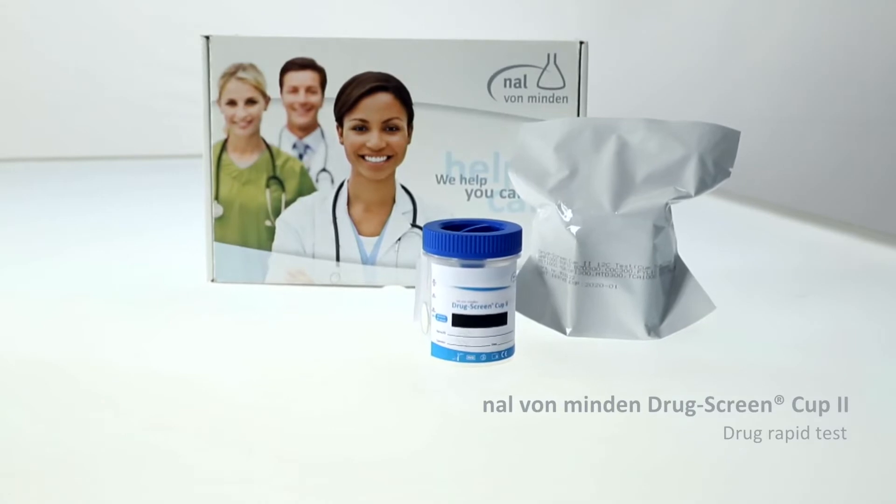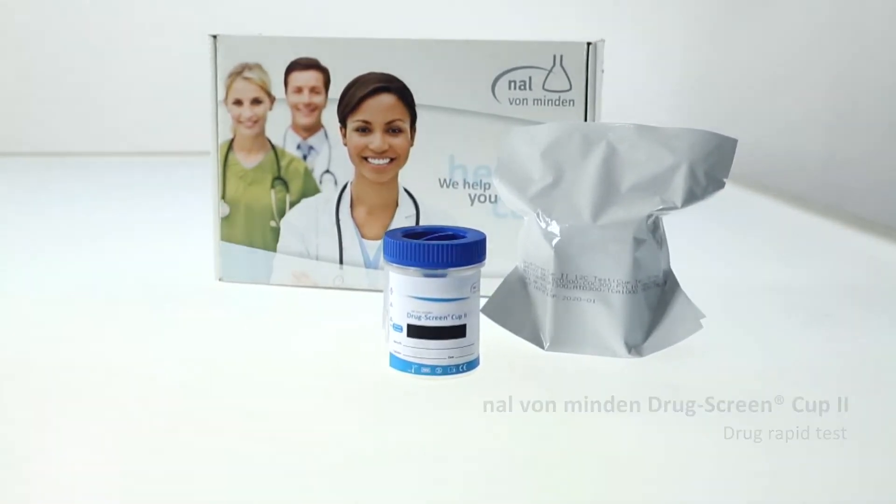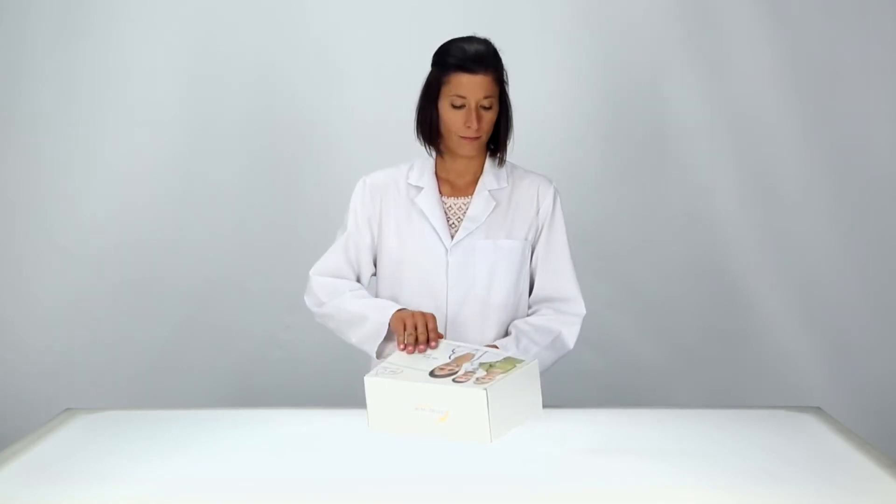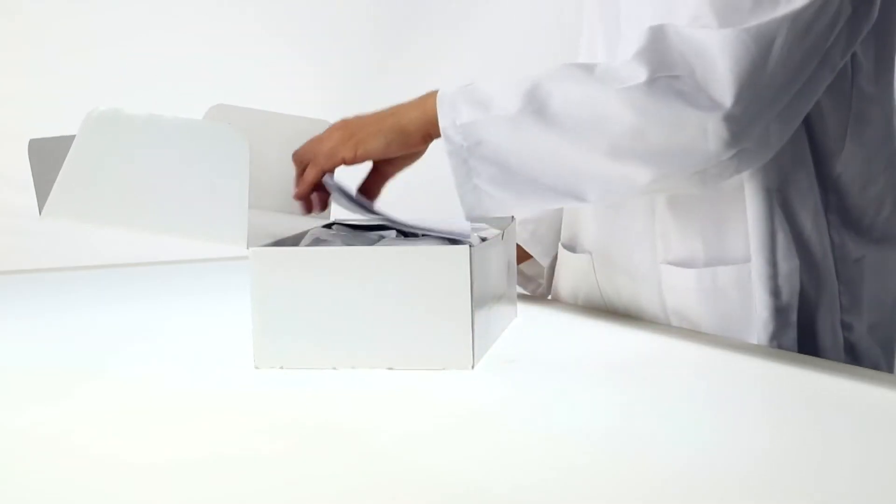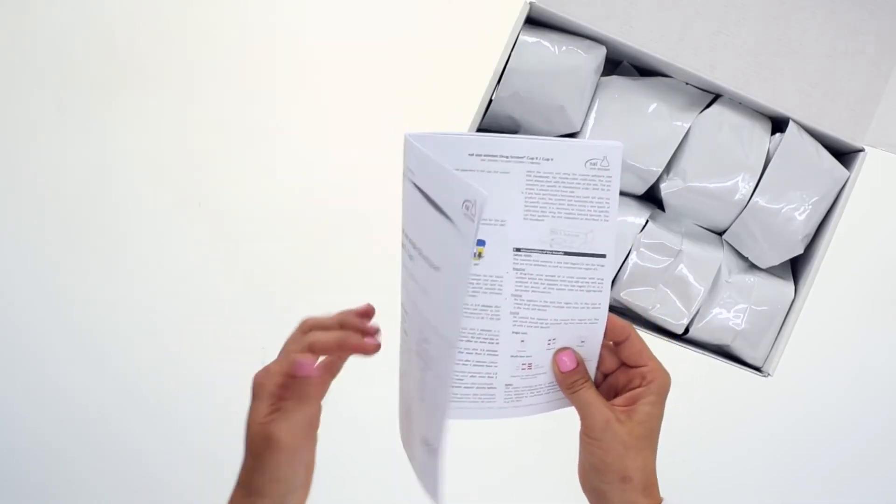The Nahl von Minden drug screen cup tests detect various drugs and drug metabolites in human urine. All Nahl von Minden drug screen cup tests are based on the same test principle. Always start by reading through the instructions carefully.